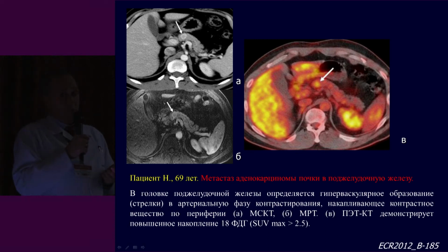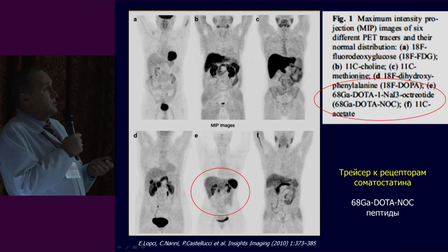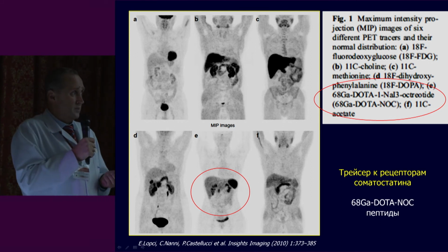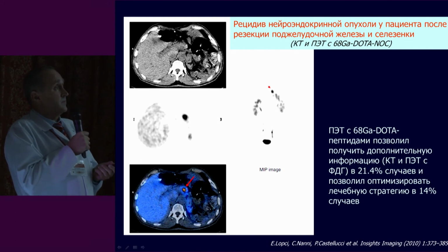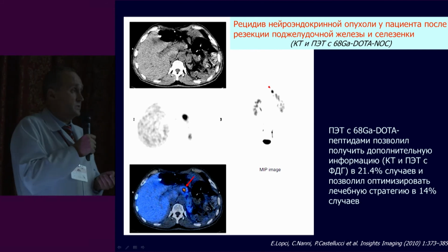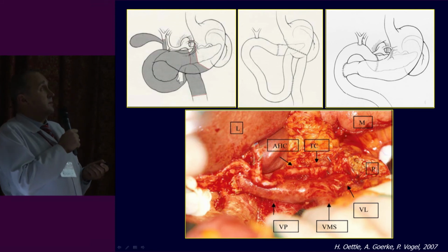And you can see that something that was first detected in MRI, by means of PET, can be classified as malignant. But there are at the moment studies in order to detect the tracers that would be pancreas specific, and certain tracers give us an opportunity to get very specific information in every 4 patients, and it's quite important.